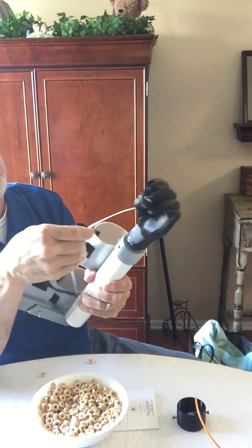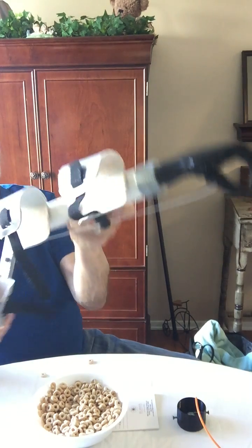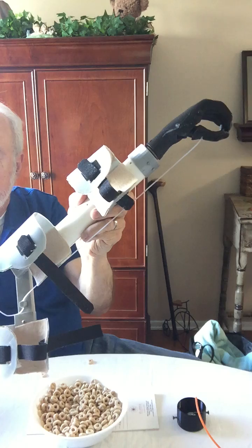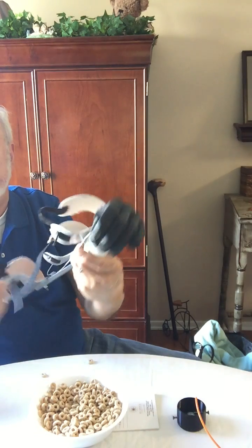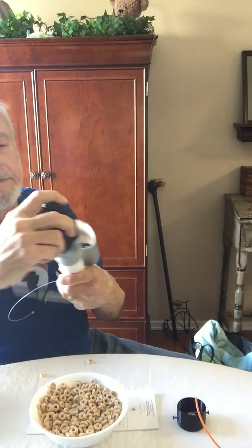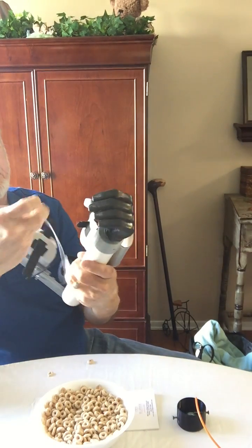But the Bowden cable just hooks right into the thumb, in this case, to the moving part of the terminal device. And the other end of it is attached to the emulator so that when you extend your arm, it pulls on the cable. And this is adjustable. It's kind of threaded like sewing back and forth through some holes that are printed into that hinge part. So you can adjust it to fit the particular terminal device that you're testing. And you can test one terminal device after another and get a comparison for how they work just by unscrewing one and screwing the other in its place, hooking up the Bowden cable.